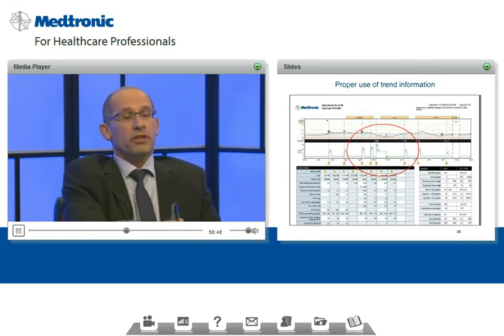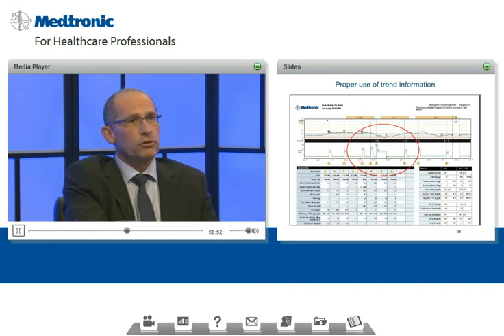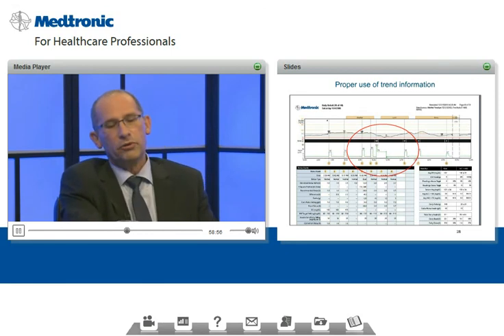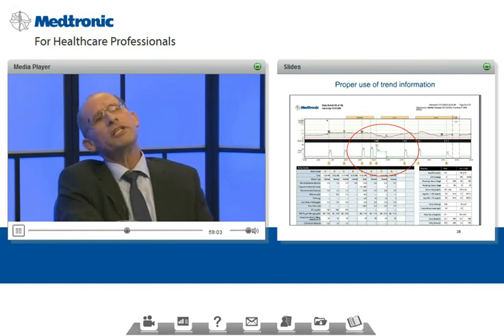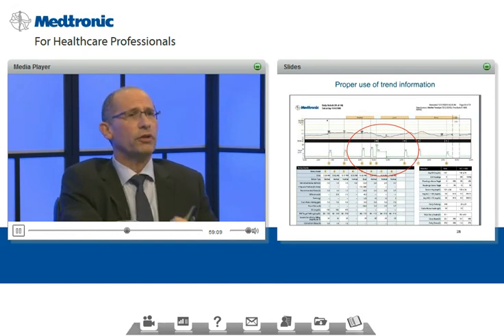Now we're moving into a time when more and more patients are going to use CGM, or continuous glucose sensing, and we believe that most of the patients will eventually learn and adopt this technology. And adopting this technology means that the patient needs to know what to do now when he has continuous glucose data flowing in.